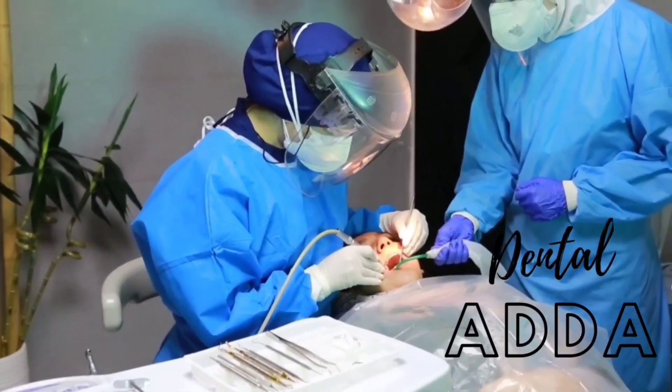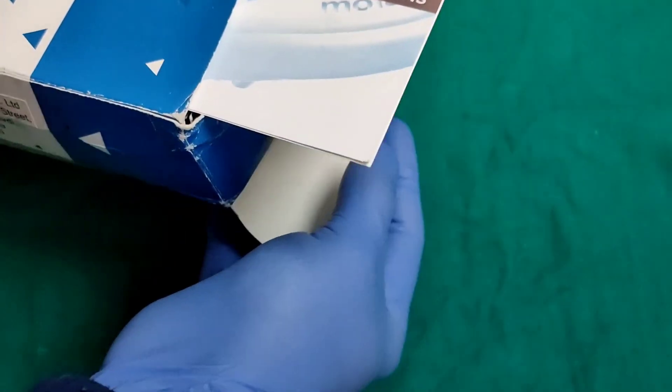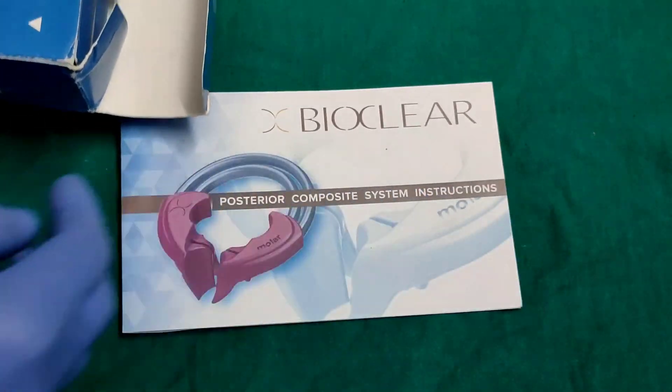Hello friends, welcome to DentalAdda. In this video, we are going to unbox one of the recent sectional matrix systems, the BioClear Posterior Matrix System.